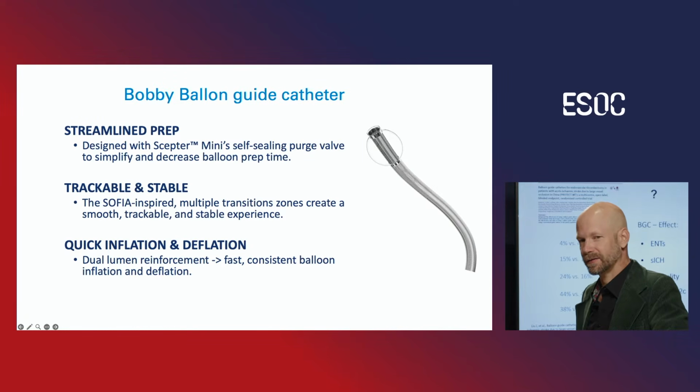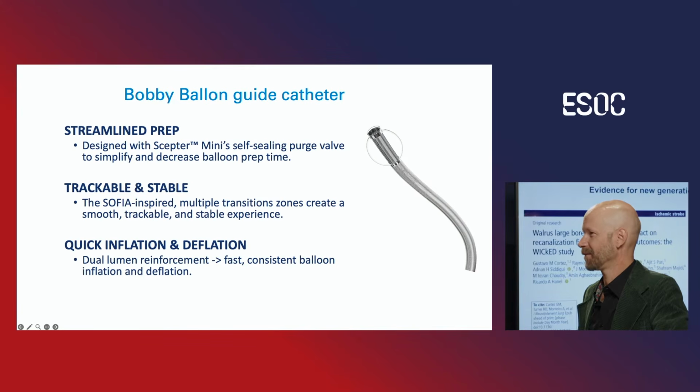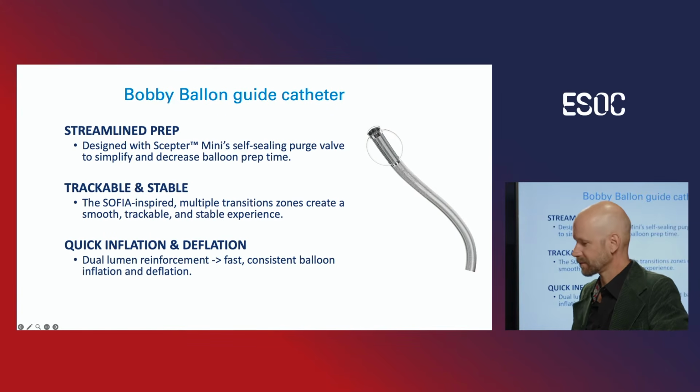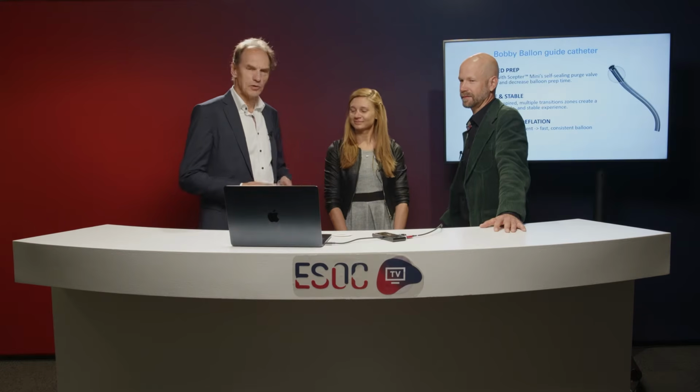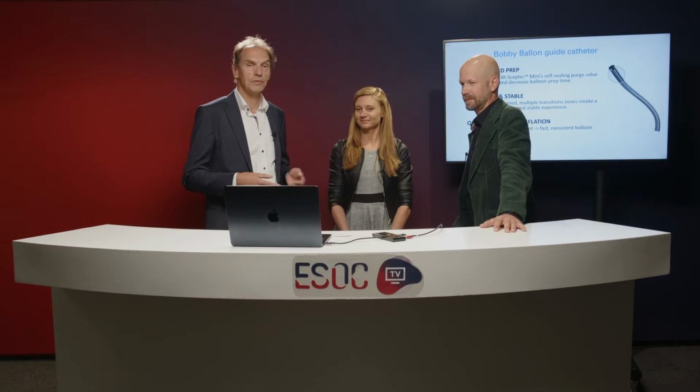And what you can do with these kinds of catheters can also be shown by an example. So Maria, you had an example of how you can use the newer generation and how it is possible to bring it to a more distal position than with the older, stiffer ones.